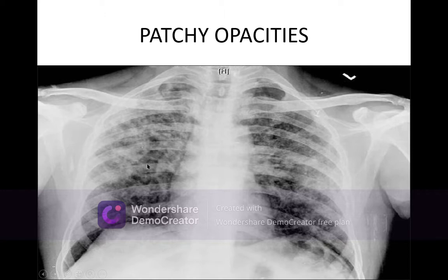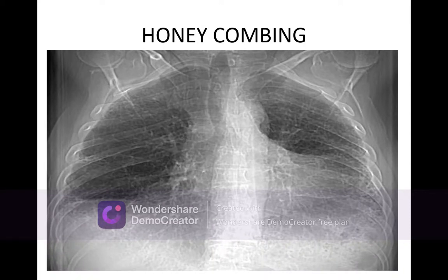Tuberculosis can cause it, fungal infection can cause it, interstitial lung diseases causing interstitial pneumonias, resulting in the patchy type of opacities. It will reduce the vital capacity of the lungs. That is a problem. They are causing the restrictive type of lung disease if you go for the pulmonary function test. Now, if the reticulations coalesce with each other, they form honeycombing, just like a honeycomb.